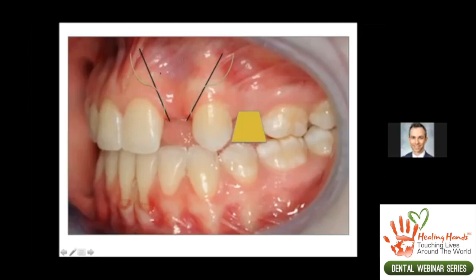If you're trying to extend the bone, or if you're trying to secure a membrane with a membrane tack further out around the bone graft, it really limits you because you have to do everything within that space. And you cannot augment the bone beyond the labial projection of the adjacent bone that's at the incision site. And usually you're not going to extend your bone graft all the way to the incision because you want to make sure that your incision will be closed and will not break down over the bone. So this is excellent for just a localized apical defect.